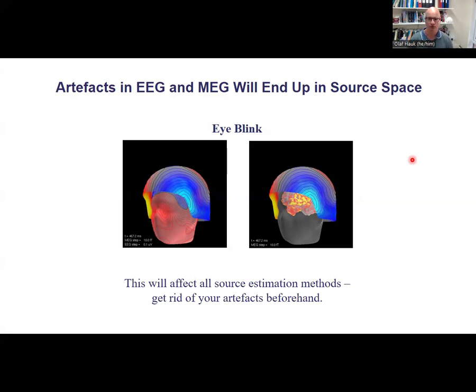So if you're interested only in visual cortex or occipital cortex, you might not care about artifacts in the front. Fair enough. But in that case, you should also not interpret anything here as frontal activity. And I've definitely seen papers and posters where I thought, well, unless you've taken very good care of your data and your artifacts, I actually think these are eye blinks that you see there in your results.